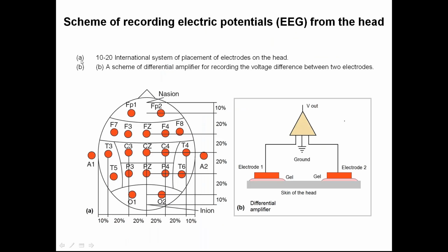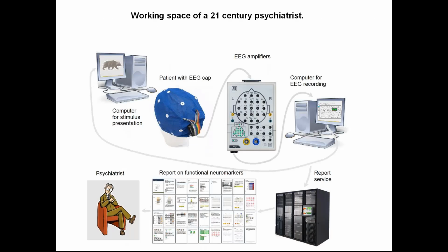Okay, you know better than me that there is a scheme of recording EEG from the head. And here I am presenting a kind of working space of the 21st century psychiatrist, which includes the amplifiers for recording EEG, the computers for presenting stimuli, and computers for EEG recording.